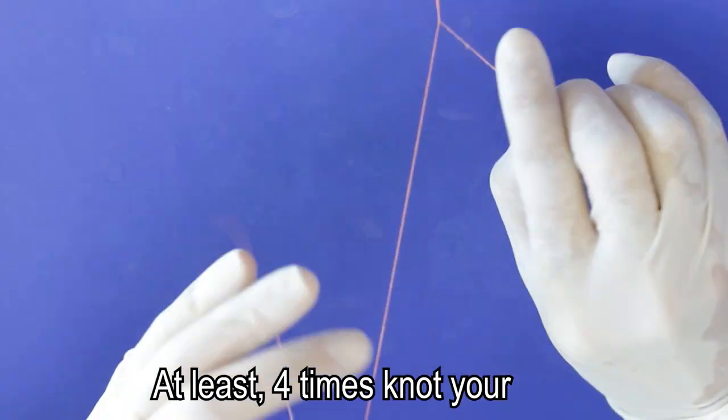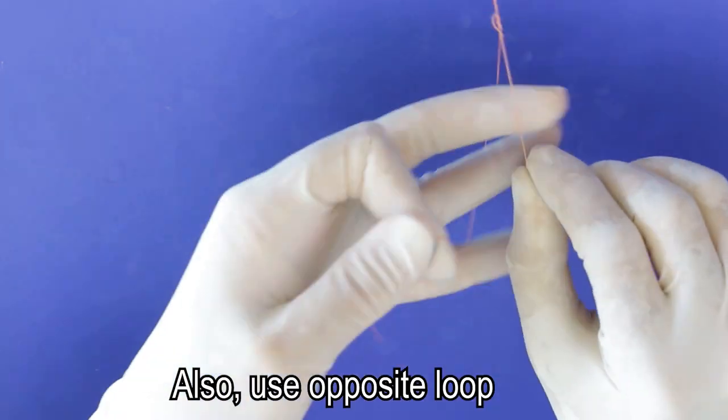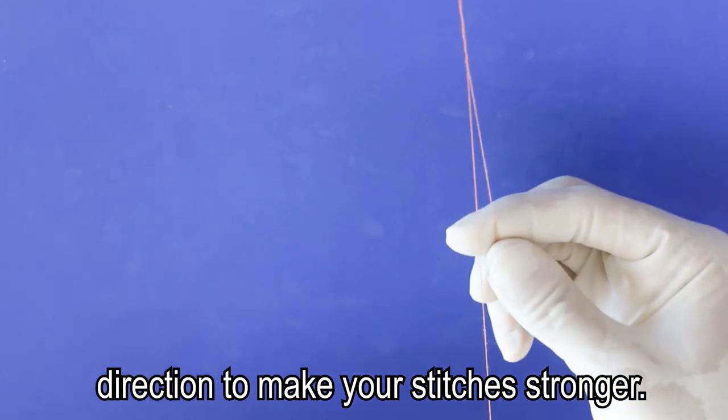At least four times knot your loop to eliminate the losing of the stitch. Also, use opposite loop directions to make your stitches stronger.